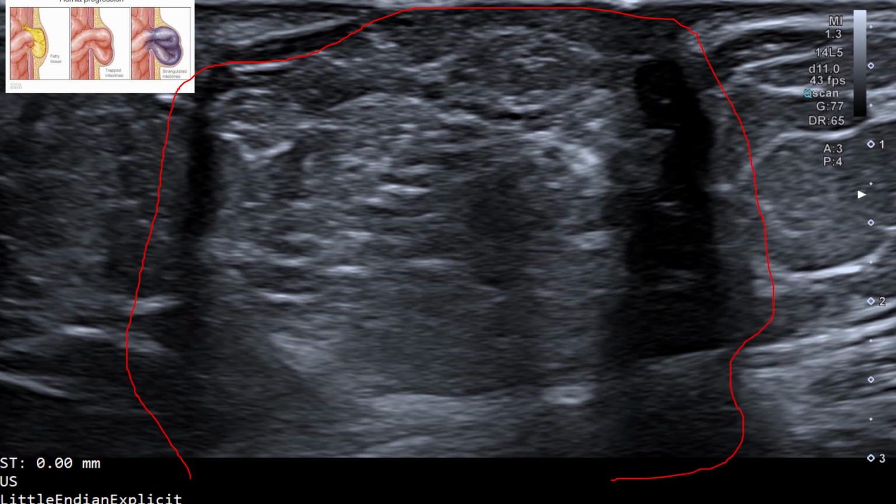You can see this outline. This one is not bowel, so this is fat that is trapped. There's also bowel that goes down there. So there's omentum, so that's an omental hernia. So this is omentum there.